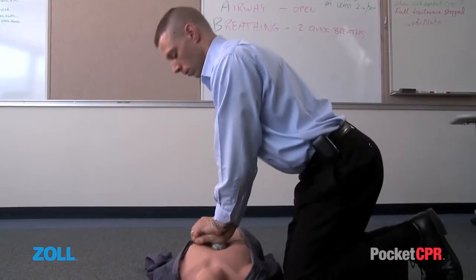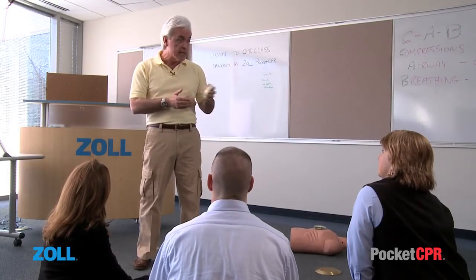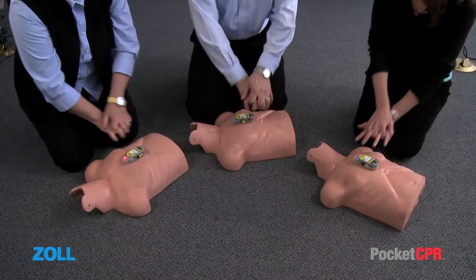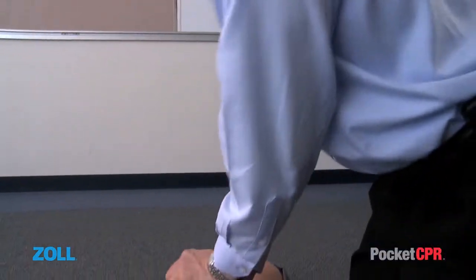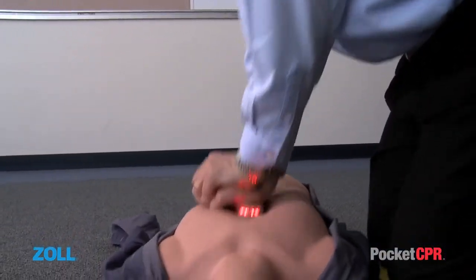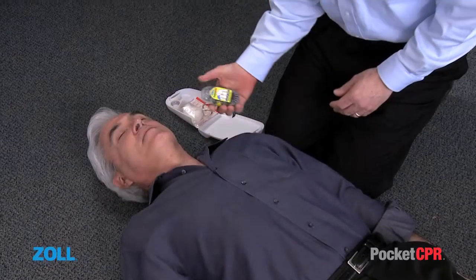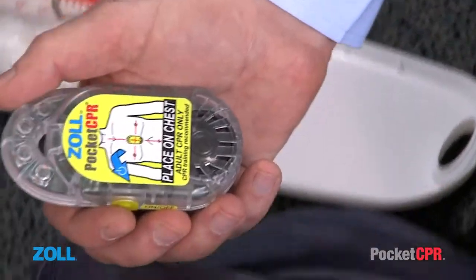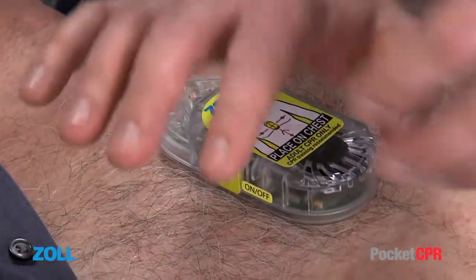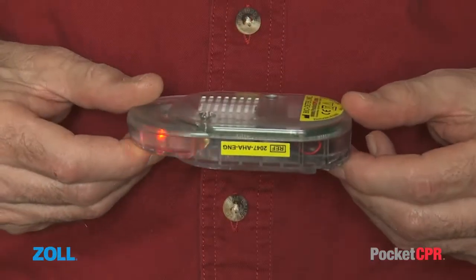CPR is best performed by trained rescuers. It is recommended that all users of PocketCPR obtain training from a certified training organization upon purchase of this device. PocketCPR may be used without training, as demonstrated in this video, but training and practice prior to use may improve performance during rescue efforts. The PocketCPR device can assist you in training exercises and during a real rescue by giving you real-time feedback about your rate and depth of compressions, and by reminding you to give 2 breaths. It can be operated in silent mode for use in training or with an AED.